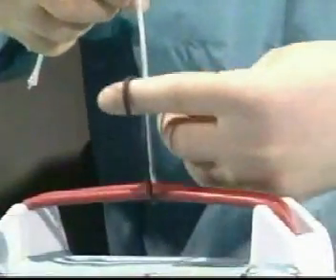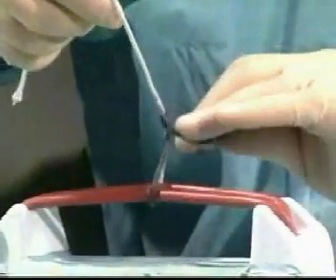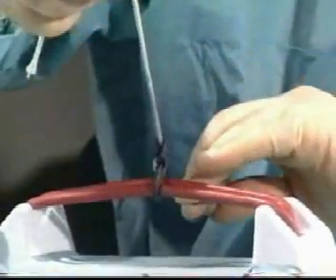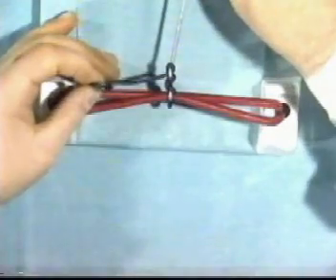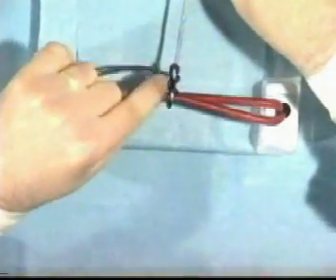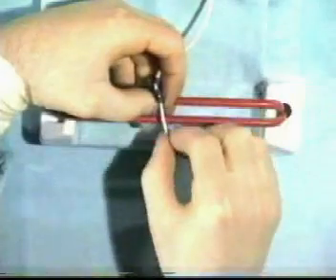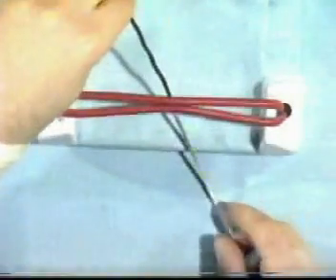One other common fault is for the surgeon to hold one end of the suture up and tie round it. Although they may appear to tie alternate knots and cross their hands, they are actually tying round the suture. You can see the white thread runs straight through the knot, resulting in what is virtually a slip knot, and the white thread can be withdrawn. This is therefore not a secure knot.